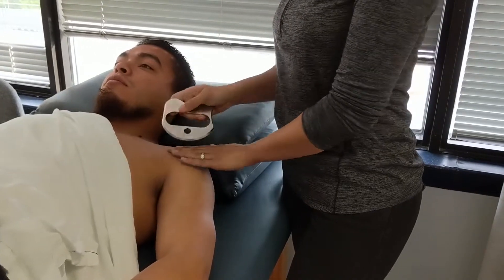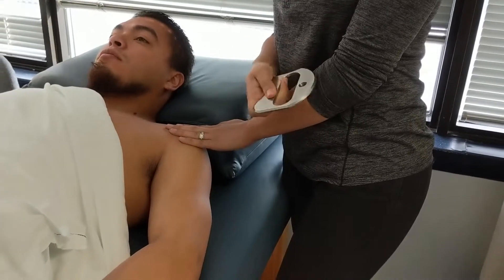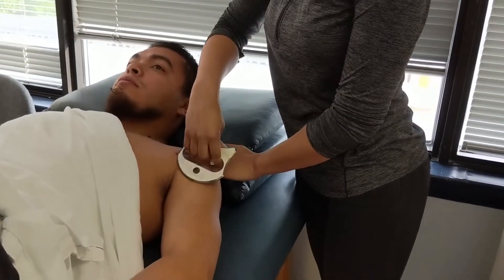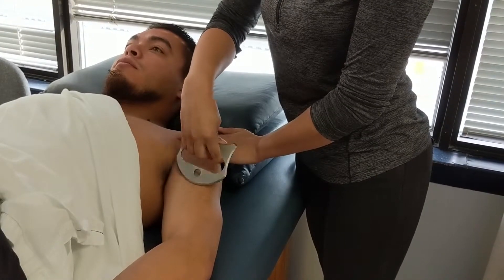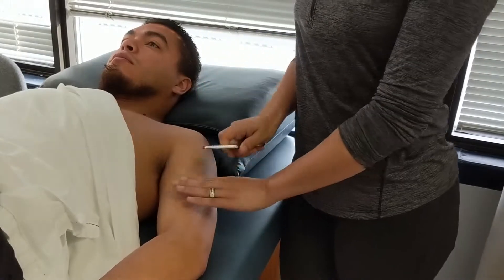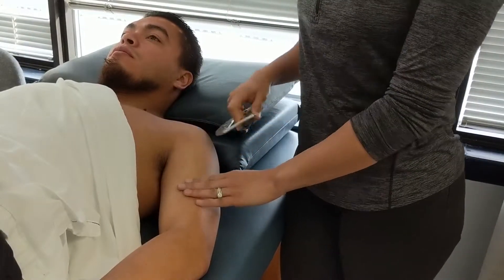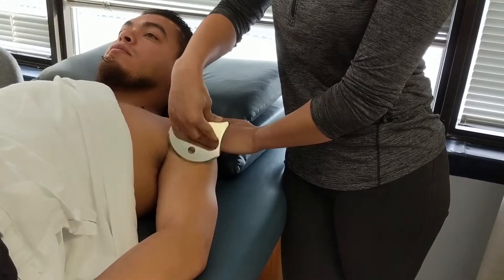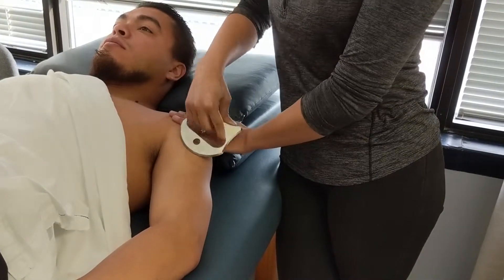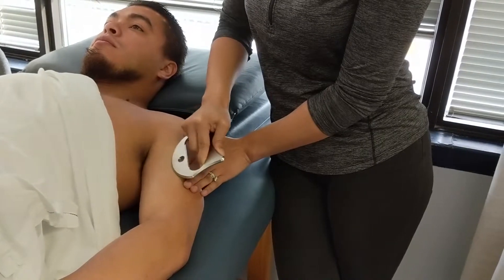You would then use the sharp edge and do the same thing — you scan, and you might feel some grittiness or a little bit of tenderness from the patient. That is when you want to do the fast sweeping strokes. You traction the skin and do the fast sweeping strokes, holding the tool about 20 to 30 degrees, and you can go in multiple directions. It's nice to know all of your fascial lines — you can go along fascial lines. A lot of times we'll go in between junctional sites, such as between the biceps and the triceps, and do some specialized techniques to try to break up any tissue adhesions.